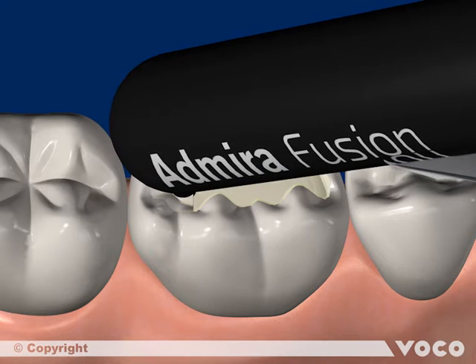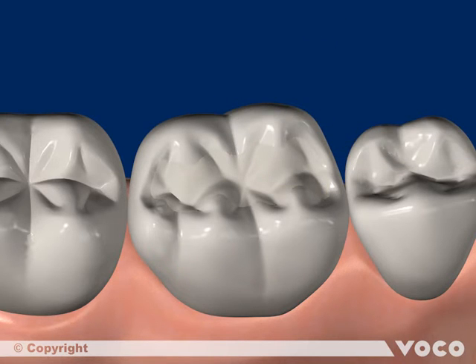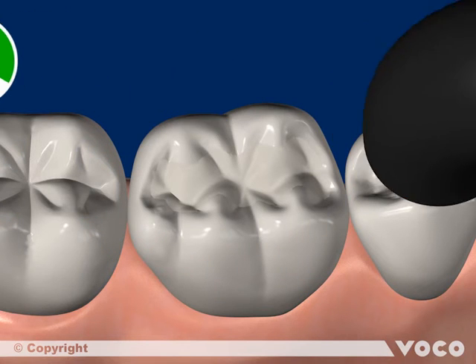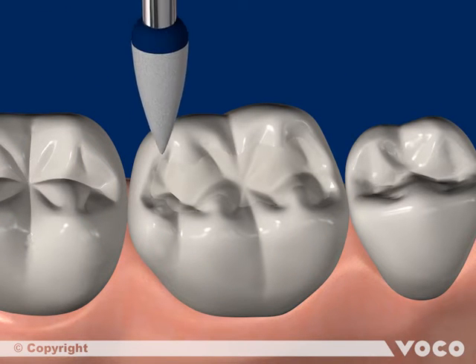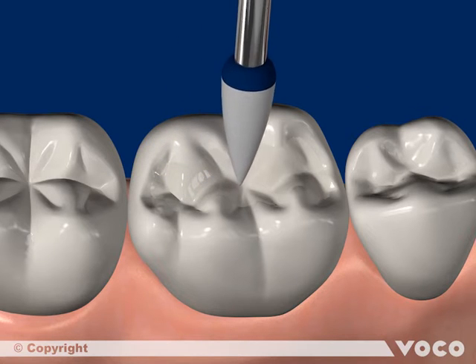Now we apply and adapt the following increment, and light cure again. Finally, the material is shaped, finished and polished, which results in a functional and aesthetic posterior restoration.